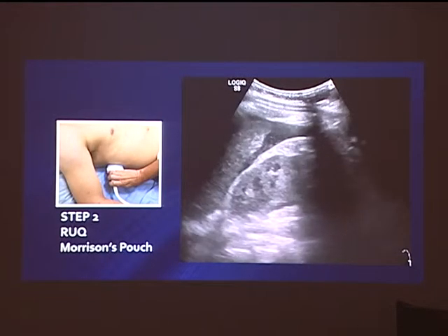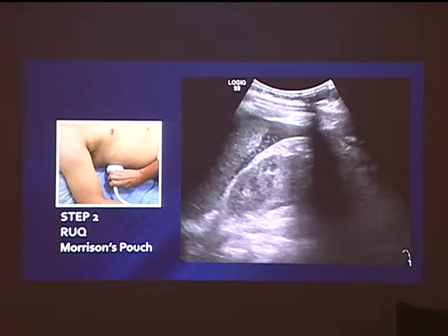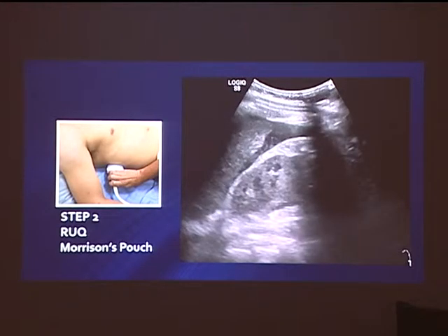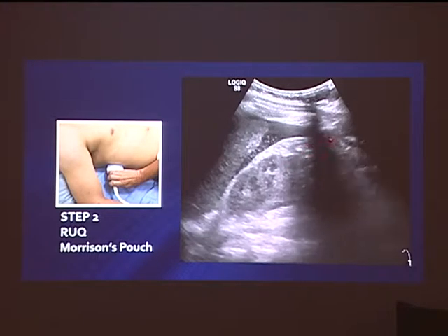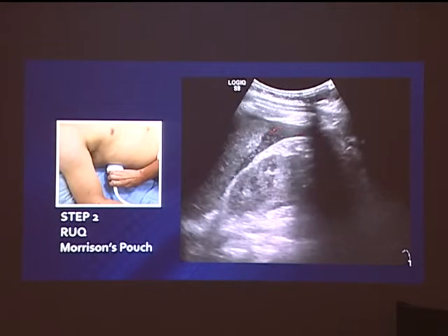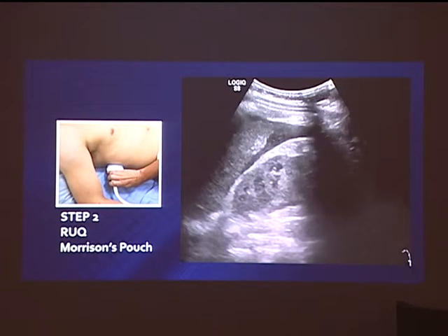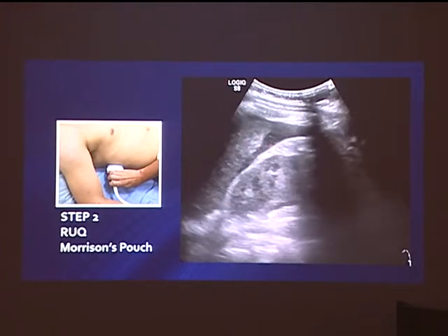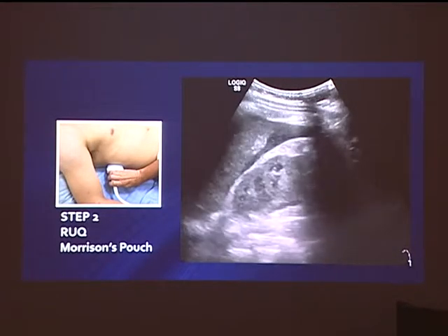This one is very obvious. This patient came in after being struck on the side during construction work and had a ruptured kidney. That was confirmed on CT scan, but here you can see free fluid with some debris — it could be tissue fragments or air, as air suspended inside fluid can also appear this way.